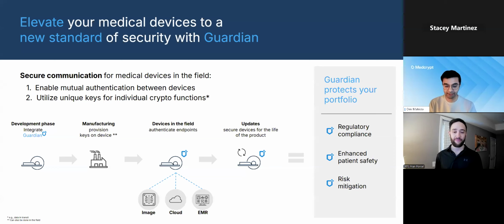But more and more device manufacturers, when they're doing next-gen devices, are now thinking about, hey, let's figure out a way to do secure updates in the field without having that in-person representative required. There's always a fail-safe, backup option of sending someone in the field.